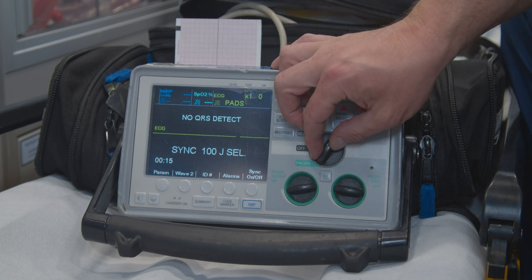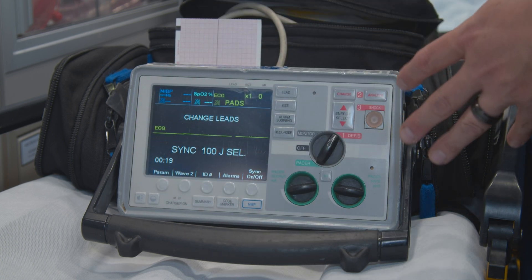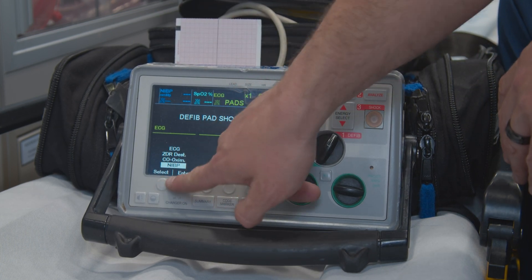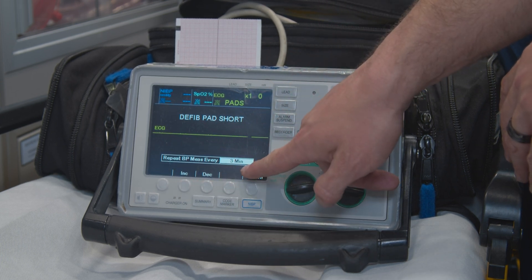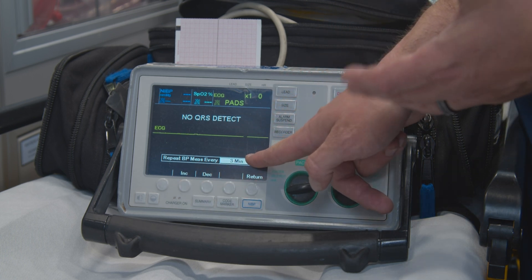If you want to, after you hook up your patient to a blood pressure cuff and have the leads going to your patient, you can hit parameter. Select through to NIBP. Enter. Go to auto interval. Right now it's on three minutes. Sometimes the default is 15 minutes, sometimes 30.